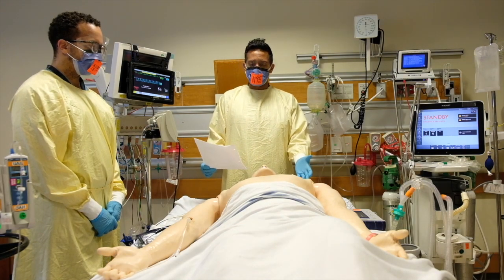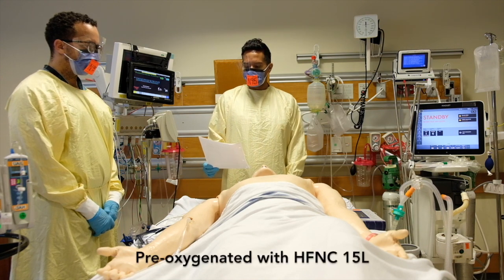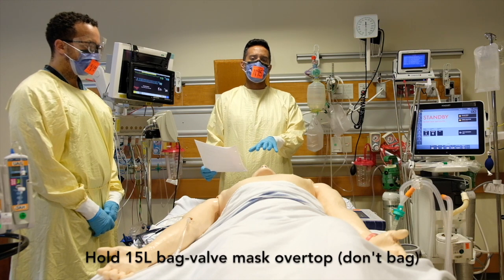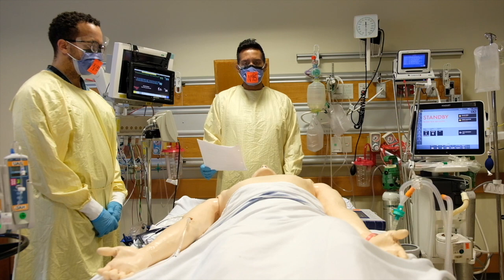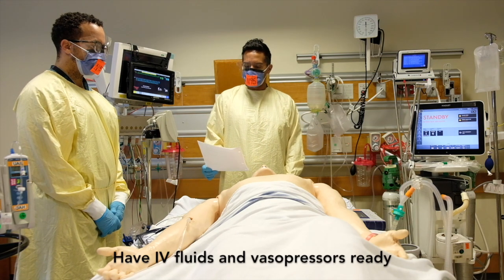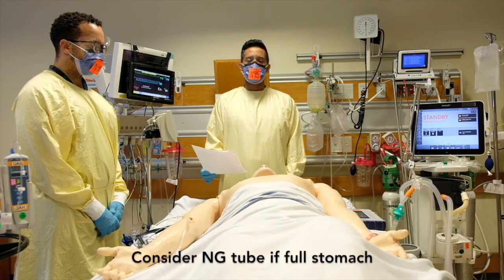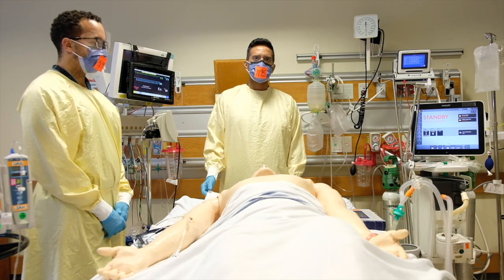The positioning is optimized. The patient is being pre-oxygenated currently on 15 liters via high-flow cannula, and we'll be putting the 15-liter bag valve mask on top with a seal with no bagging to ensure pre-oxygenation. The patient is already on pre-intubation fluid bolus as well as vasopressors. This patient does not need a pre-intubation NG because he has not eaten recently, and we have 2 IVs that are in place.